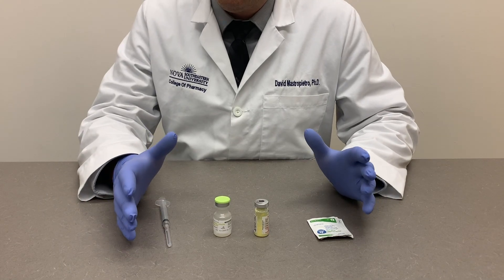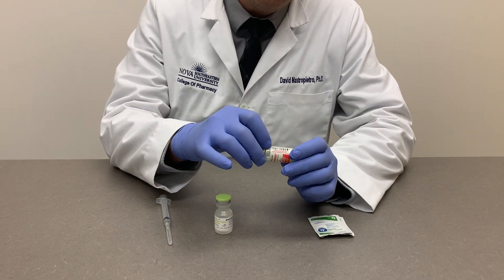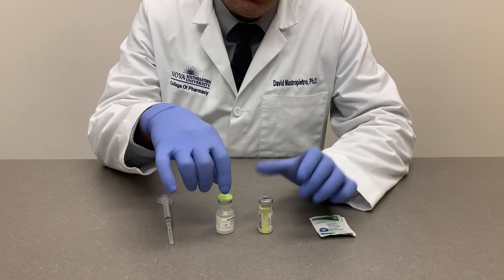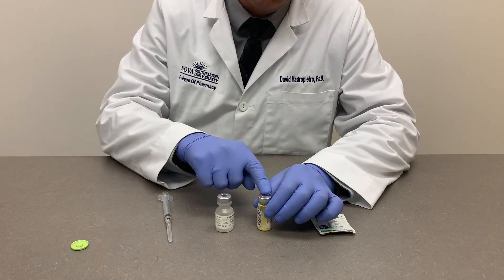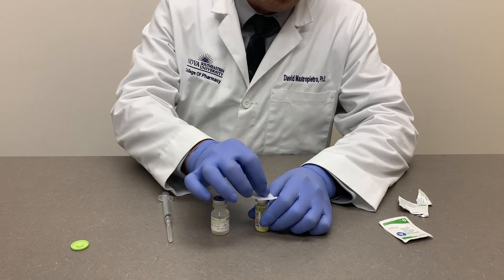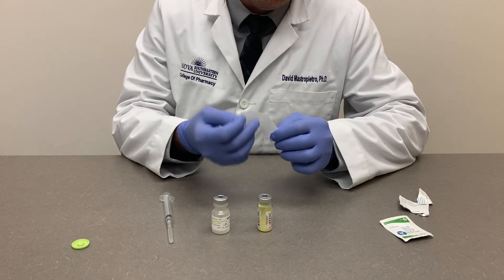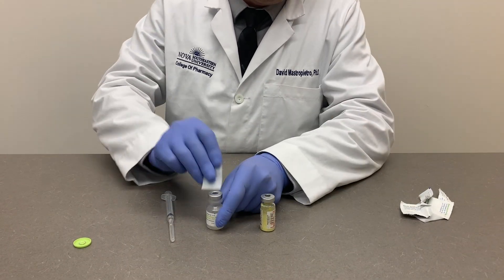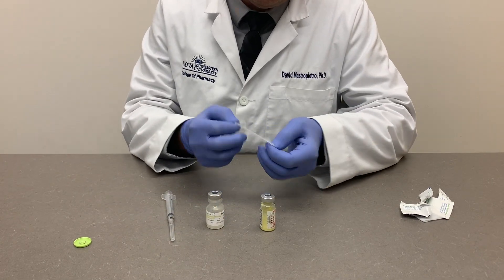Some vaccines require that the contents of the vial be reconstituted using a liquid prior to administration. After removing the protective covers, utilize the alcohol swab again, wiping in the same direction — preferably three times, using a different side of the swab each time. Do the same for the diluent vial: one swipe on one side, a second swipe on the second side, and a third swipe on the third side.